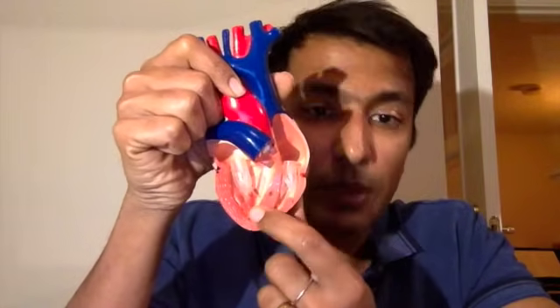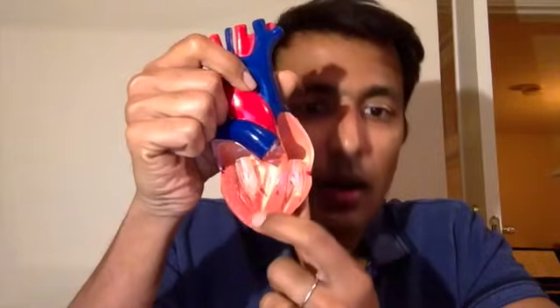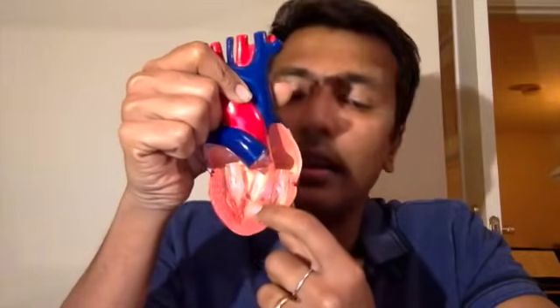Okay. Then there will be some mention of the thickness of these walls here, the muscle walls here, all right? Why are these important? Because the heart is a muscle. If the heart is having to work harder, it will become more muscular, like with any muscle. If you look at my bicep, for example, the harder I work my bicep, the bigger it will become, the more muscular it will become. So with the heart as well, this is very similar to that. If the walls look more muscular, then that tells you the heart is working harder.